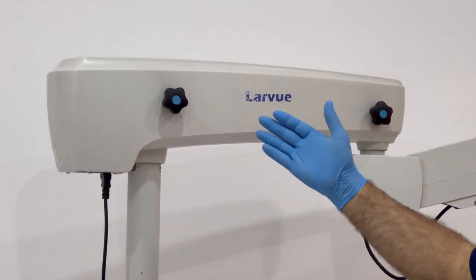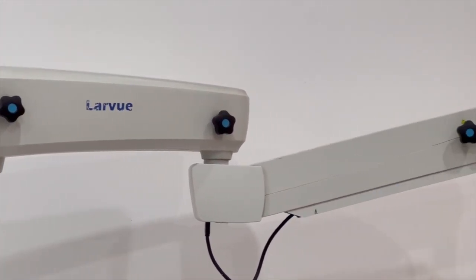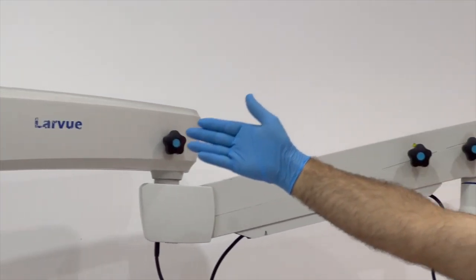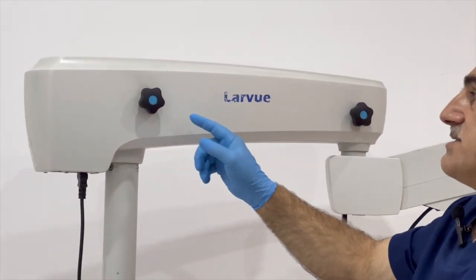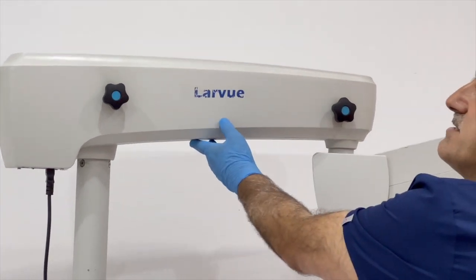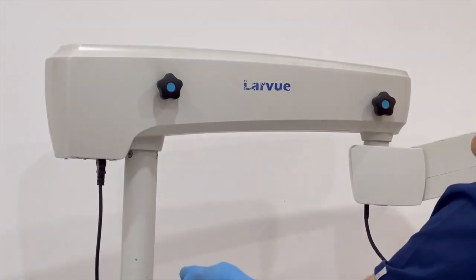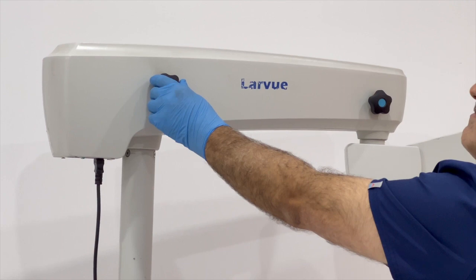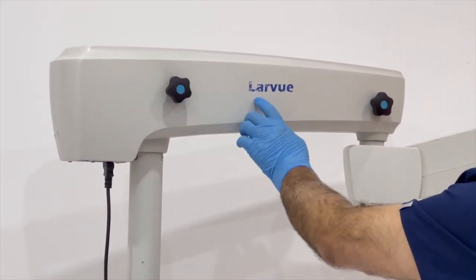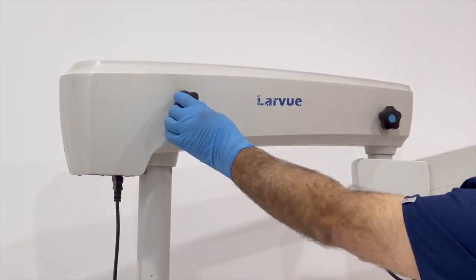First of all, we know that this is the primary arm, this is the secondary arm, and this is the balancing arm. About the primary arm, this screw is responsible for controlling the horizontal movement of the microscope. When I tighten the screw, the microscope will lock, and it depends on you how loose you want the arm to be. So you may make it tight or loose.